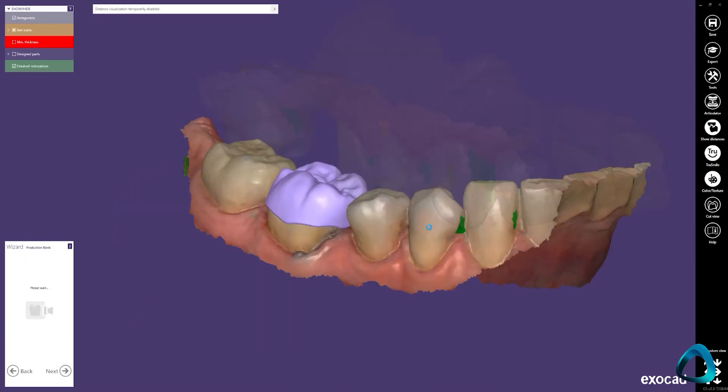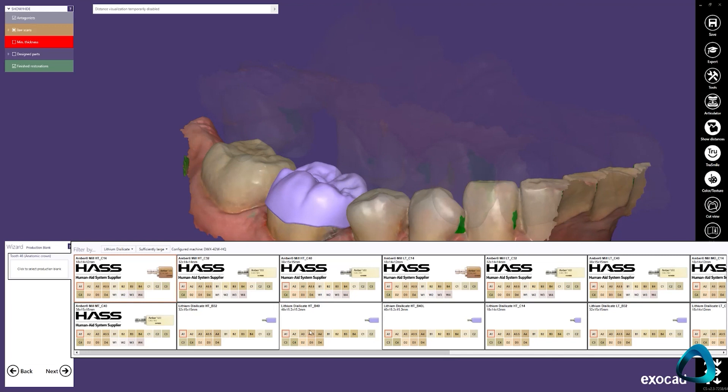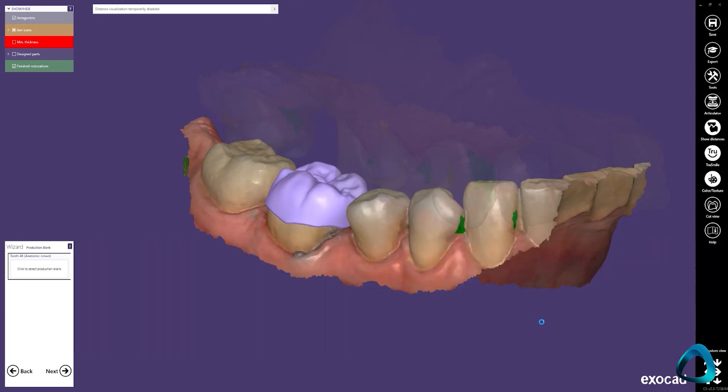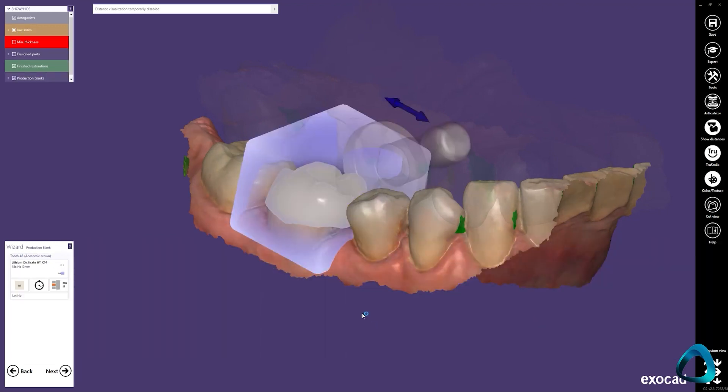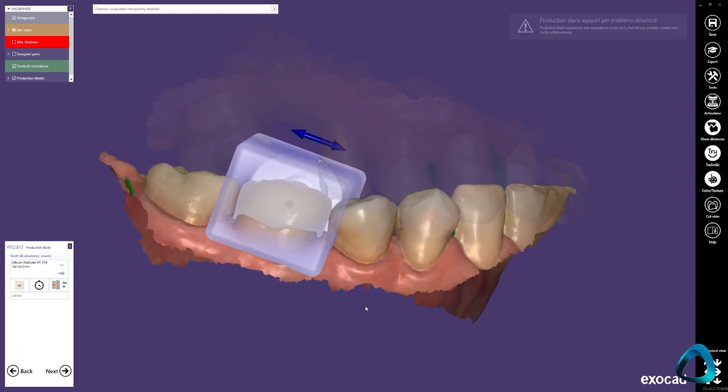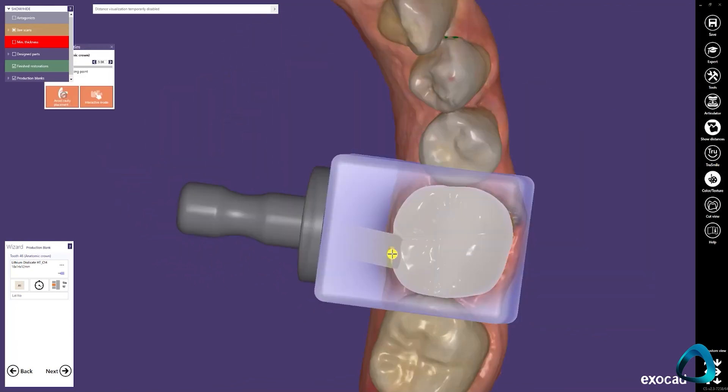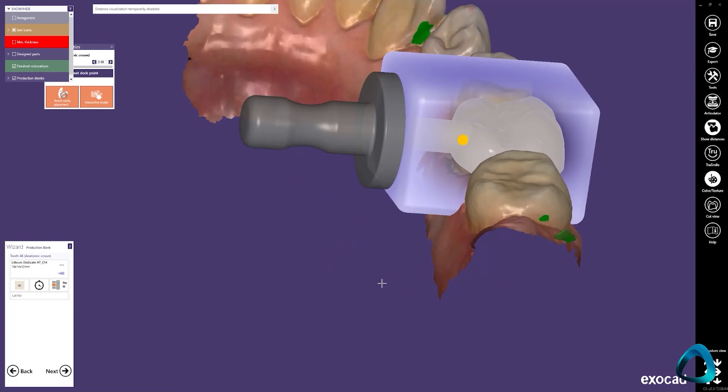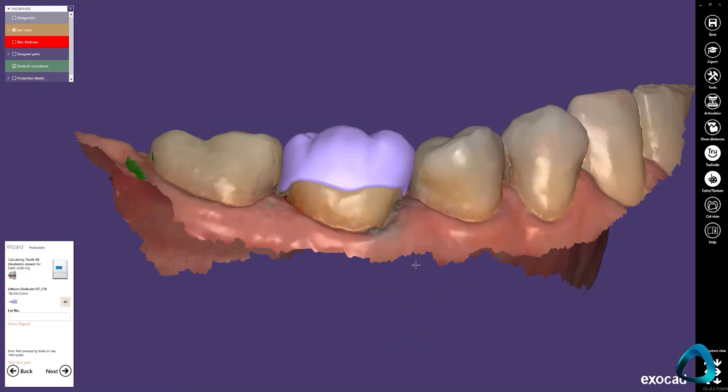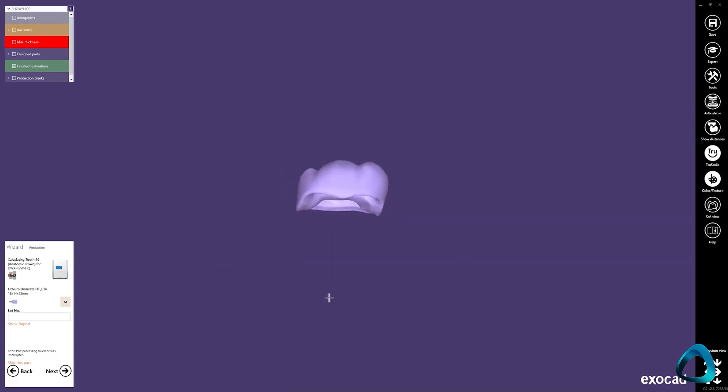The final part of the workflow is fabricating the crown. Proceed by choosing the right block or blank of material for your restoration and nest the restoration within this material. You can adjust the sprue so it avoids any critical areas such as contact points or margins. Finally, you are ready to mill. Send the restoration to your CAM software and begin the process.